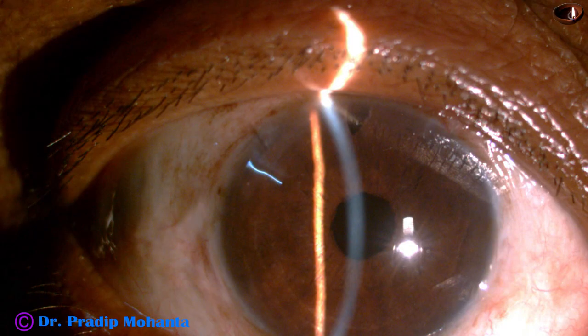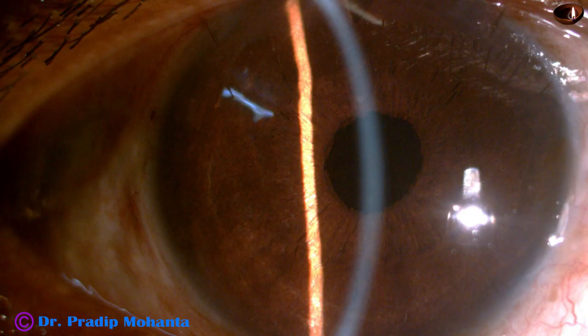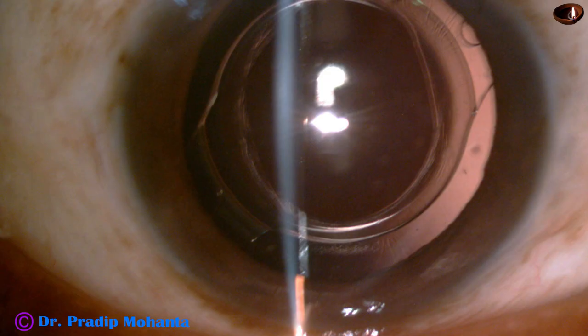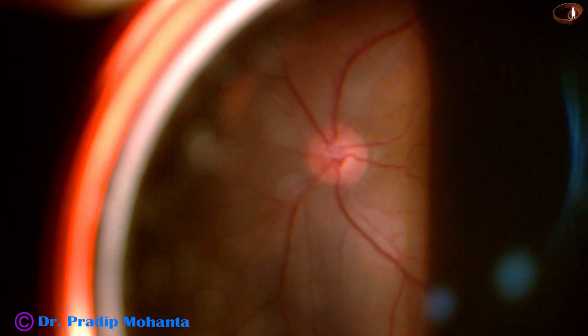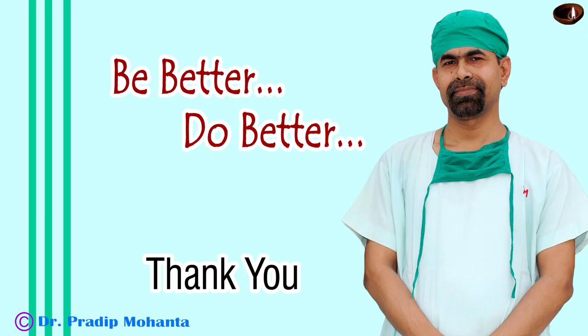These are some post-op pictures after one week: the cornea is clear, anterior chamber is quiet, unaided visual acuity is 6/18 and with optical correction it is 6/9. The patient has no complaints. The lens is nicely placed in the sulcus. The 90D picture shows a very good optic nerve head; macula is okay but there is a tributary vein occlusion. Thank you very much for your attention — hope this video will help you in managing your posterior capsular rupture cases.